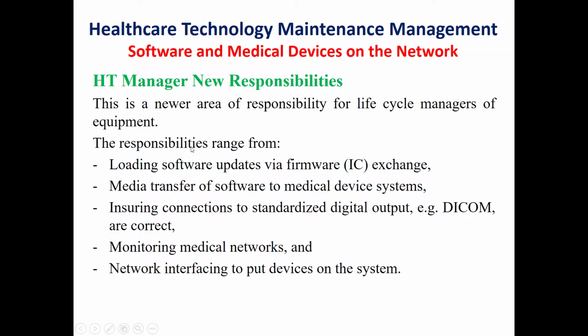These responsibilities range from loading software updates via a firmware IC exchange. So in case we have new software updates, this can be done using an IC. So we replace an IC on an electronic board instead of connecting to a direct computer or laptop.